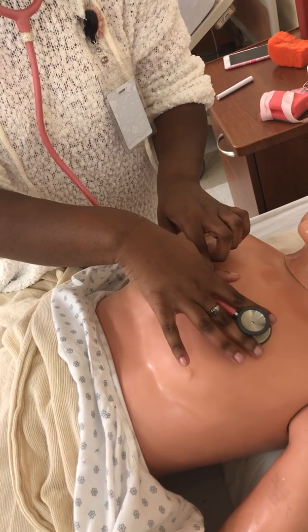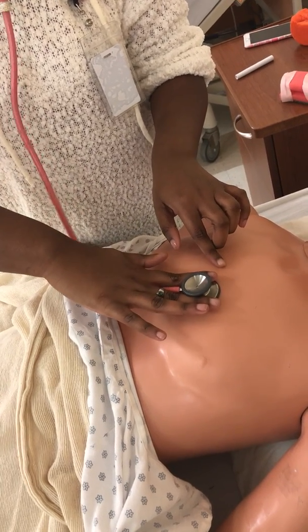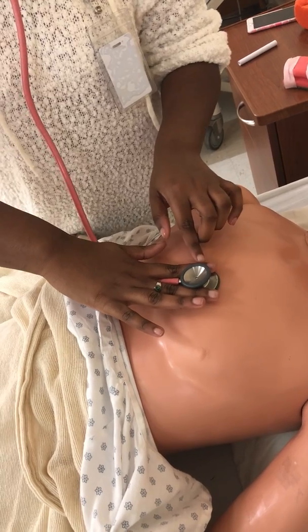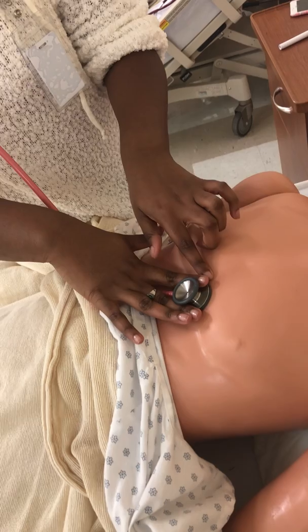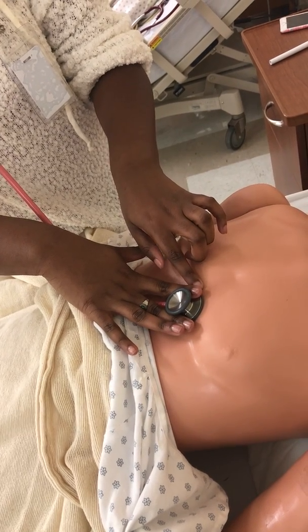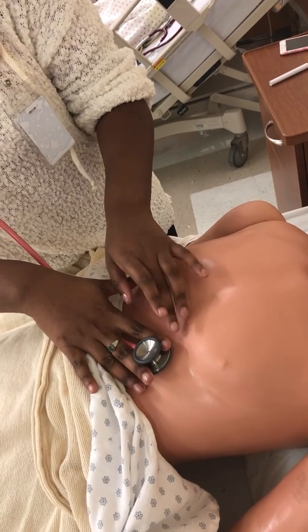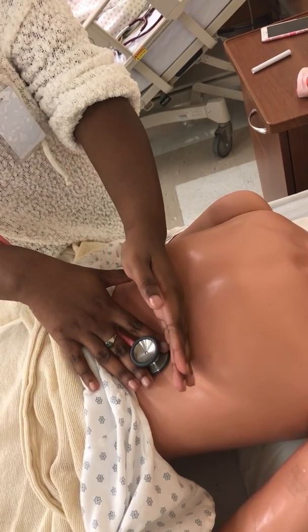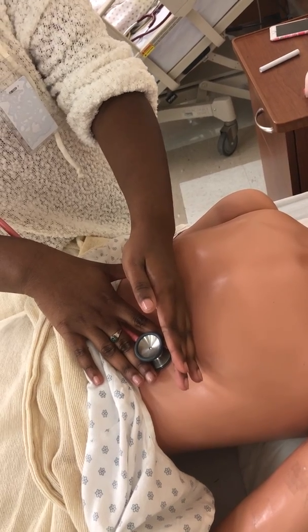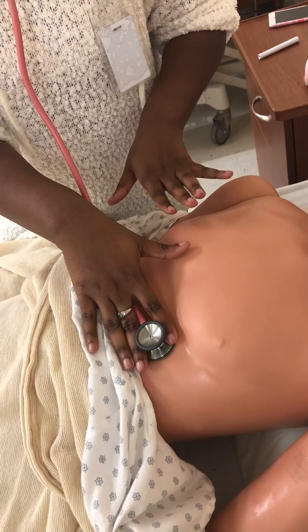Now going down 3 intercostal spaces to the left, which is the Erb's point. Now going down to the 4th intercostal space, which is the tricuspid. Now going down closer to the mid-clavicle line, the 5th intercostal space, which is mitral. And while I'm already here, I will listen to my patient's heart sound for a full minute.